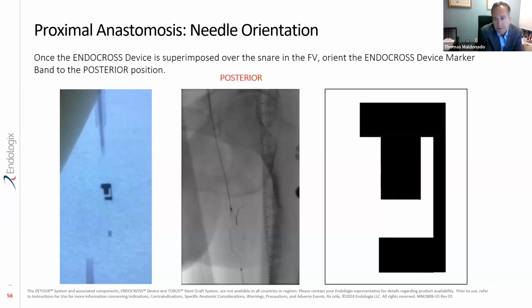There's a question about the reason for the venogram, Vince. I have my own reasons for being so particular about that venogram, but why do we do a venogram at the end? I don't know. I mean, you should have all the information that you need at the time of your procedure. You know what I mean?